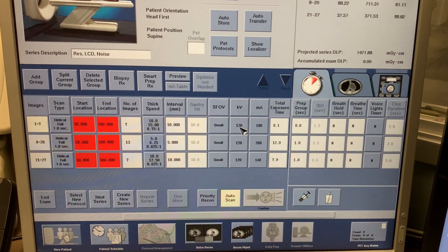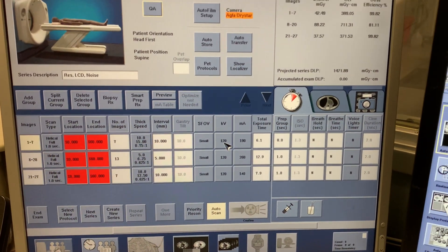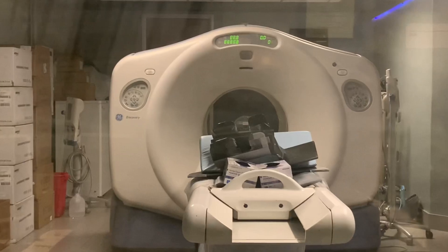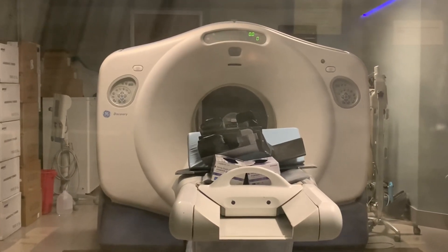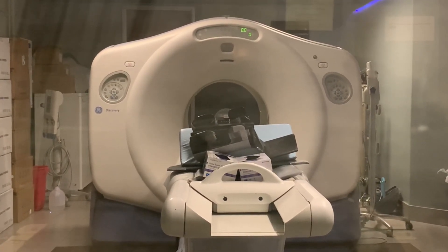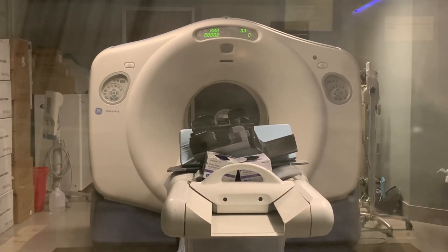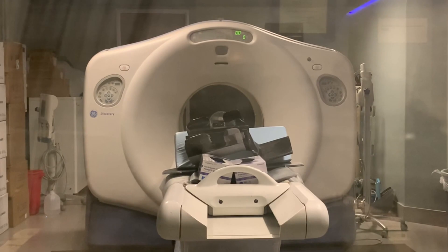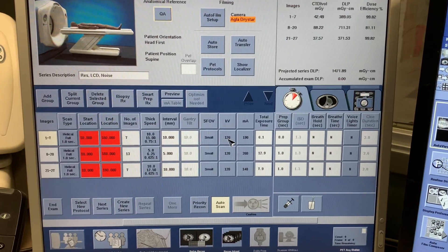Red boxes under the CT scan location tab indicate a system scan condition that must be resolved before the software will allow scan operations to resume.